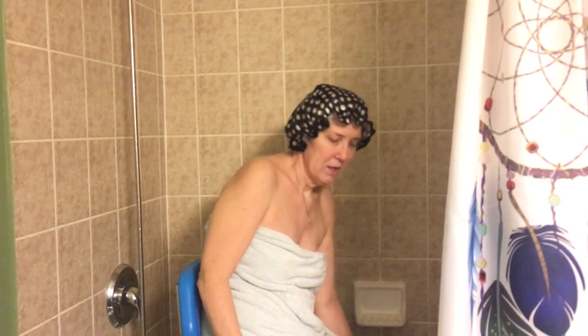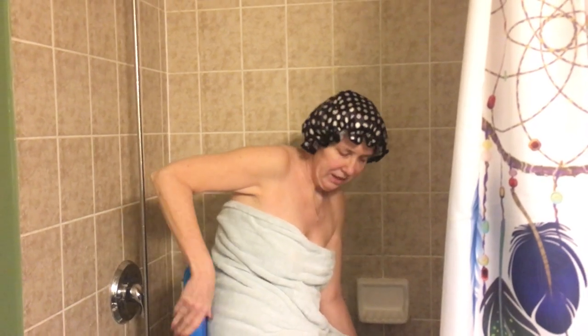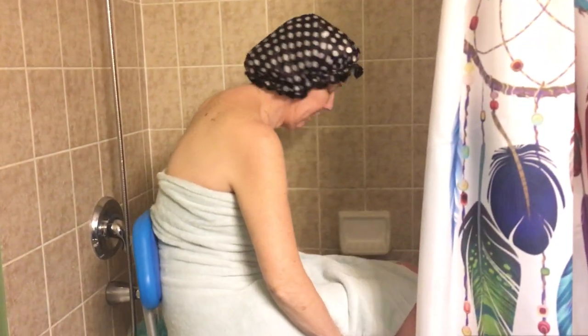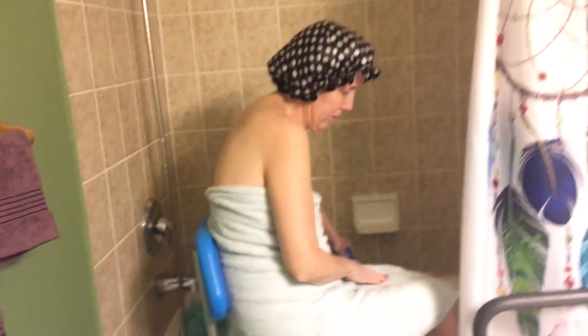I don't have an accessible bathroom. So this chair underneath me right here — there's a button that I push. When I push that button, there's a nice sidearm here, and it slides me out over the bathtub.